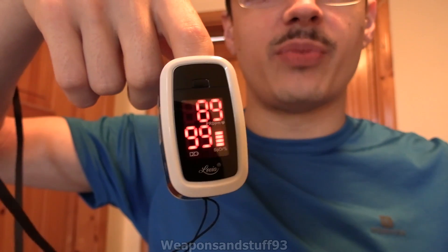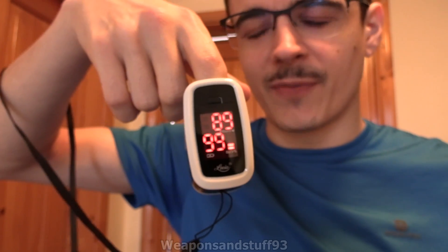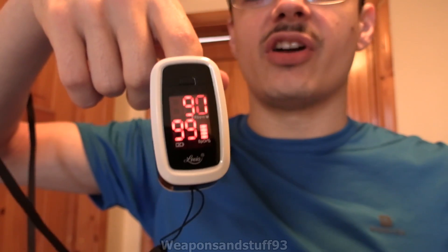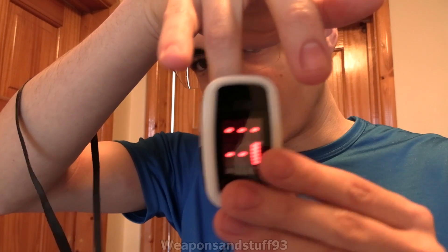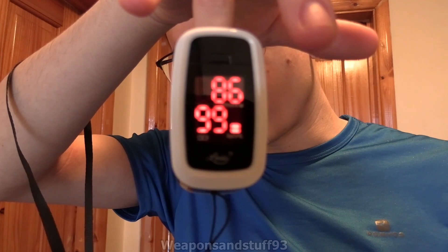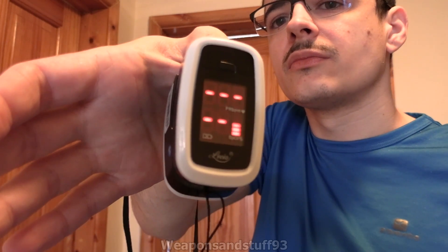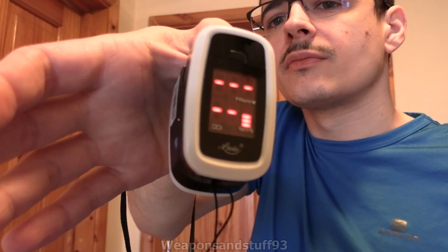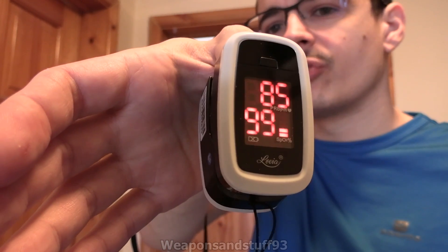In general, I think resting heartbeat for most people is between 60 and 100, so that's in that range. Again, if I wasn't talking on camera, I'm sure that would be a bit lower. But 99 blood oxygen is very good. Let's just put it on a different finger to see if we get a different reading — it's always worth doing that a few times. There we go, it's taking a reading again. 99 again, 86. Let's just try it on the thumb — and yeah, same results. We know it's working fine.